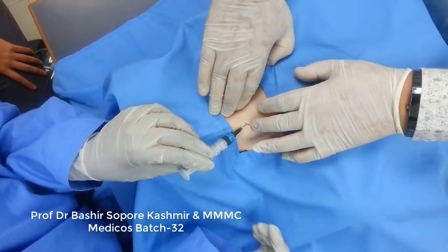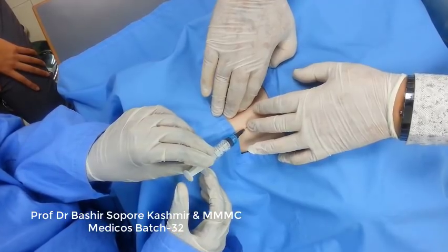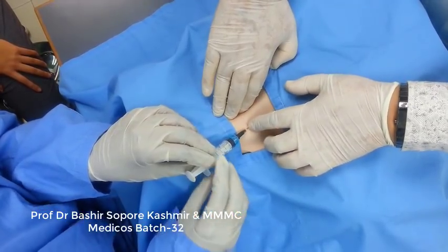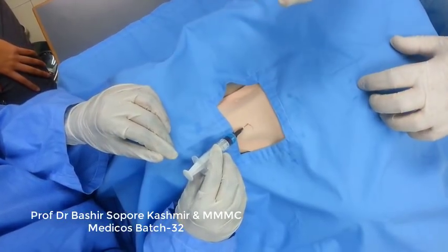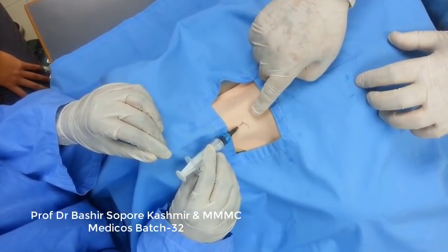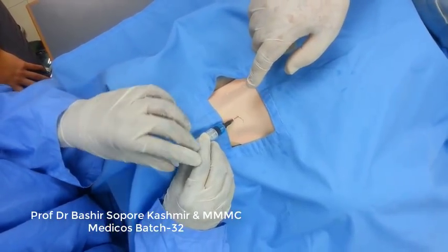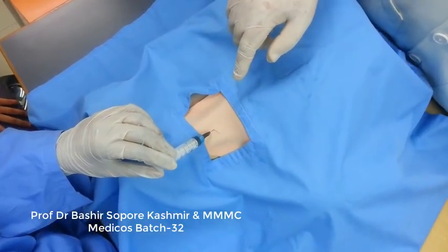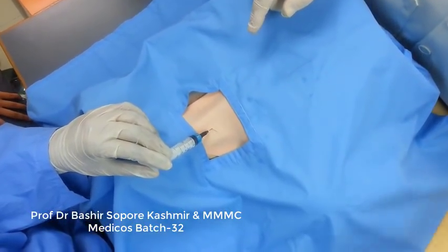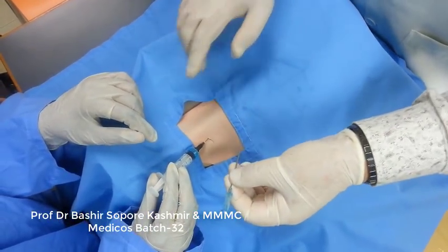One more thing: you keep the needle there. Now this needle will act as a guide, because we know that this needle is in the internal jugular vein. Then you take another needle, what is called the introducer needle. The introducer needle is 2.5 inches long, and it is 18 gauge.